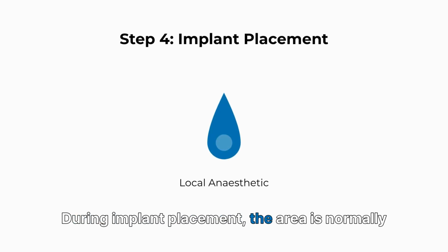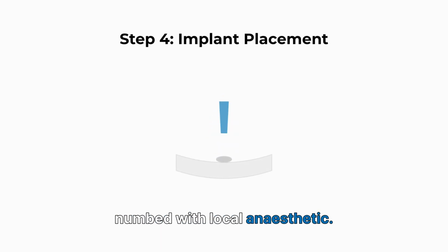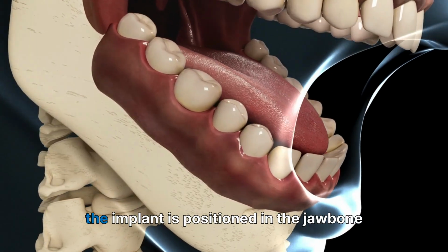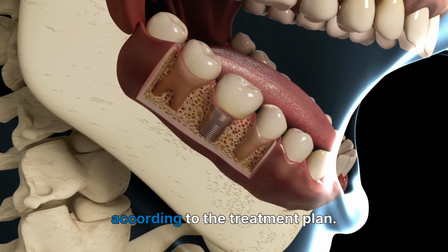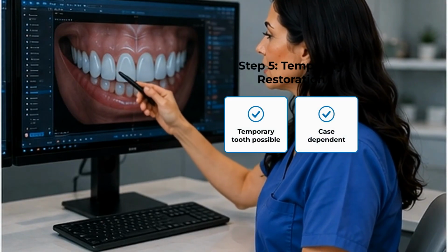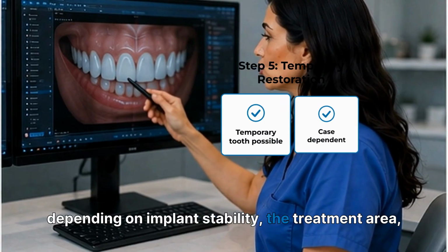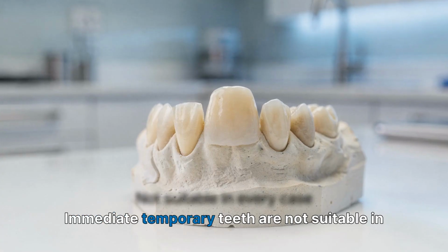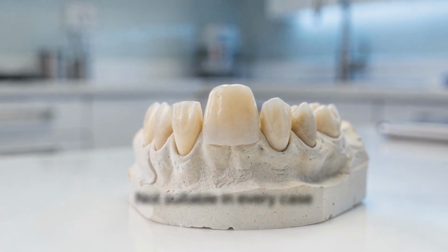During implant placement, the area is normally numbed with local anesthetic. The implant site is prepared carefully, and the implant is positioned in the jawbone according to the treatment plan. A temporary tooth may sometimes be provided depending on implant stability, the treatment area, bite forces, and the clinical plan. Immediate temporary teeth are not suitable in every case.